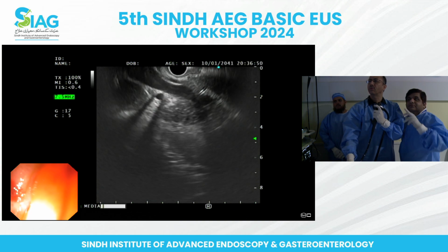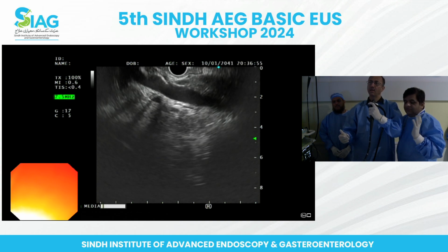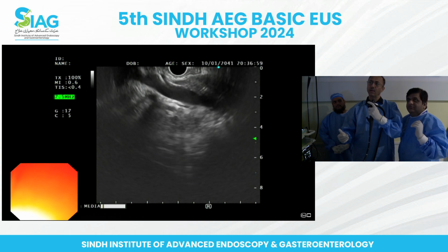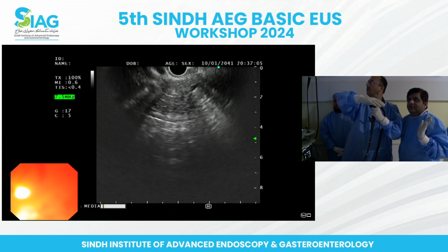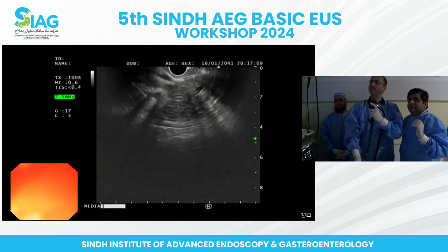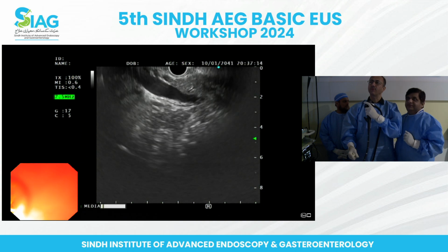There you go. Okay. What I've done? Just change the position of the endoscope. So big wheel up. On this side we have the pancreas. On the left side we have the liver. So just a small movement, and you're able to go to the point of your interest.